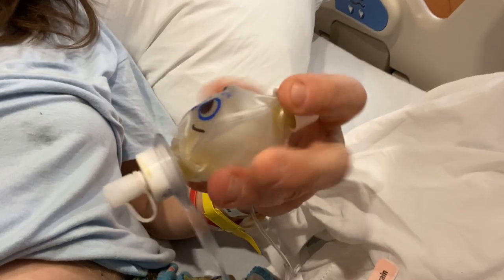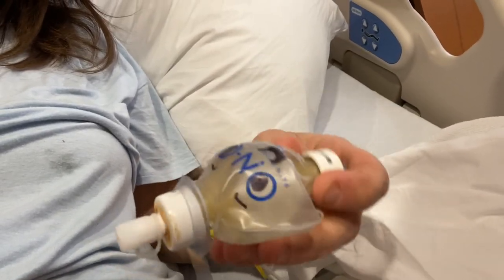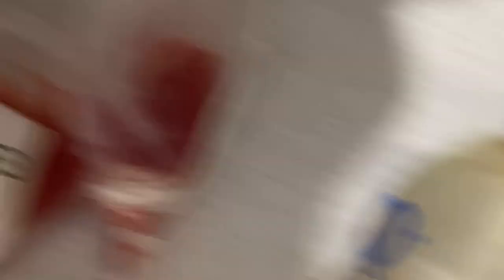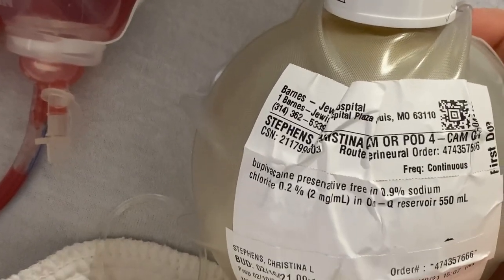This one is still pretty full, but if you look at this one, you can see it's kind of getting wrinkly, and that's because the bupivacaine — the anesthetic — is draining out in there. The anesthetic lasts like three days, so this will just get smaller and smaller and more wrinkly until it's all empty.